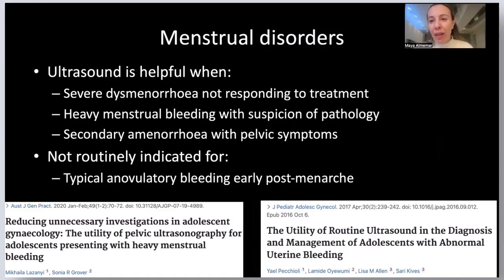But I should say that generally, when we're looking, particularly in the first couple of years after periods start, and we're trying to reassure girls and assess girls with heavy or painful periods, on the whole, ultrasound tends to be normal. And the reason for that is that most of the problems related to heavy and painful periods is related to anovulatory cycles, which are very common early on after menarche. And therefore, there are many studies that show that ultrasound doesn't necessarily change our management in those first few years when we're scanning for difficult periods, as about 70 to 75% will be normal.